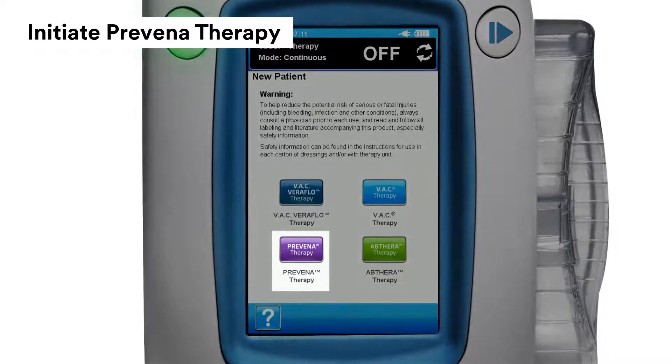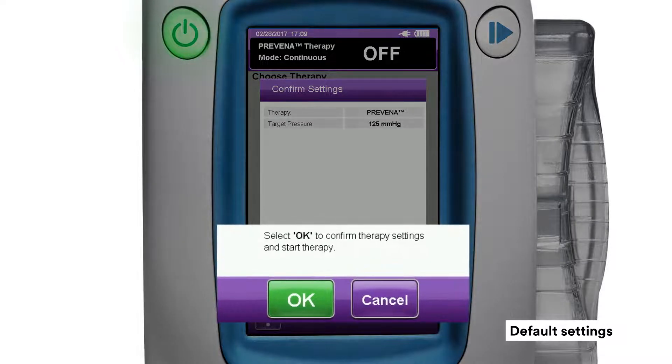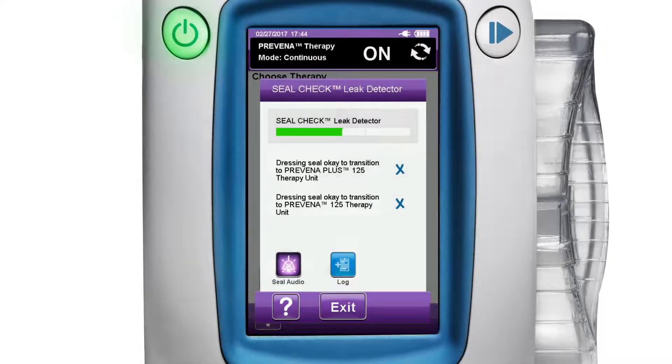To initiate Prevena therapy, press the purple Prevena therapy button. Next, press the green OK button on the confirmation screen to accept default settings and begin Prevena therapy. Confirm the seal check, then press the purple exit button if not transitioning to a Prevena therapy unit.